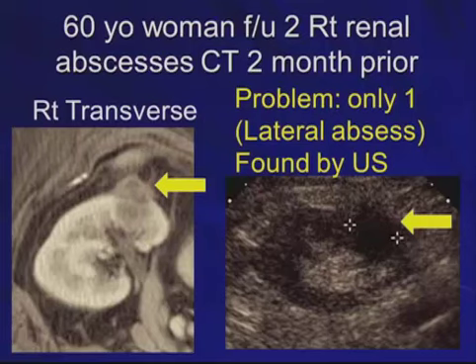Well, one of my most experienced sonographers took the patient into a room, and what happened was he found one of the abscesses, but he couldn't find the other one. And he didn't use co-registration because he was pretty confident he was going to be able to find it. He's a very experienced sonographer. Well, he comes to me with this result, and I said, you know what, that's not good enough.